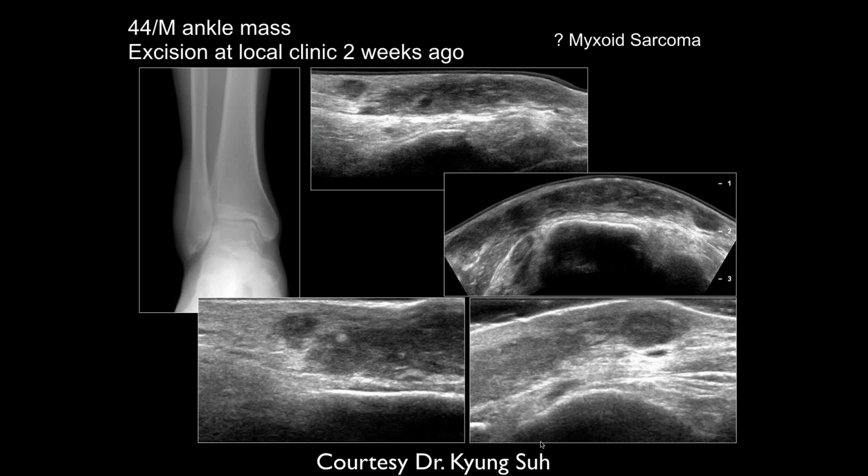All right, so we got the 44-year-old male with ankle mass excision at a local clinic 2 weeks ago. We have an x-ray of the ankle demonstrating soft tissue swelling of the lateral ankle. There's some heterogeneous mineralization of the adjacent bone of the distal fibula. On the ultrasound images, we have an inhomogeneous echotexture hypoechoic ill-defined lesion of the lateral ankle.